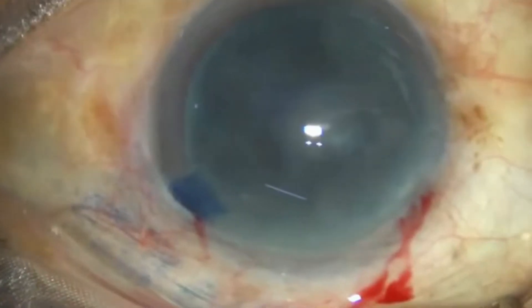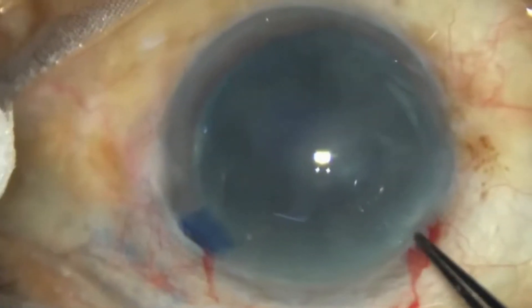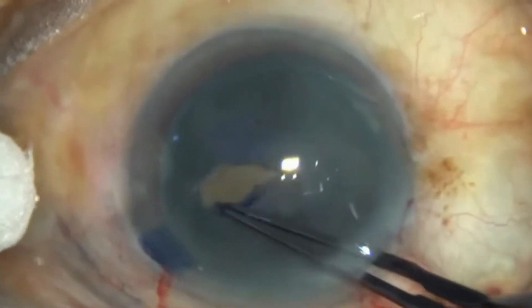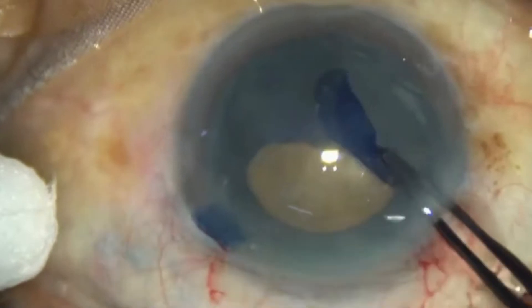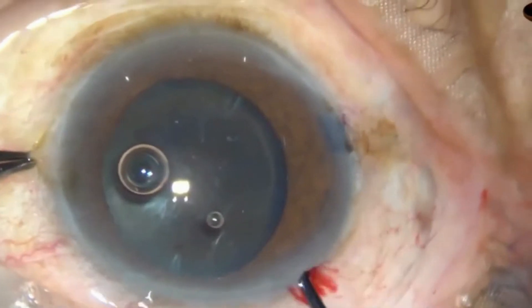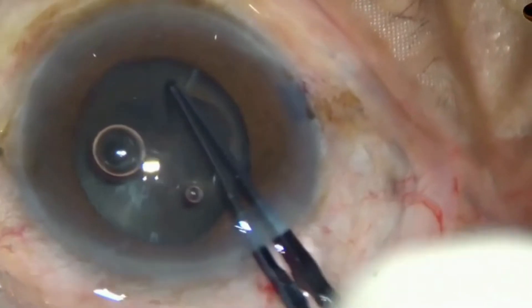Various instruments and devices have been developed to facilitate the creation of a CCC, including needle capsulorrhexis, forceps capsulorrhexis, manual capsulorrhexis, and two-stage capsulorrhexis. Several mechanized systems have also been developed to facilitate CCC.